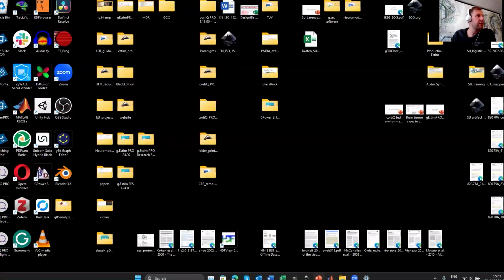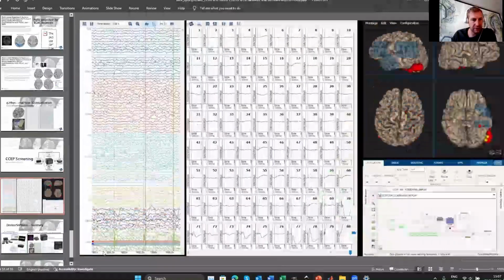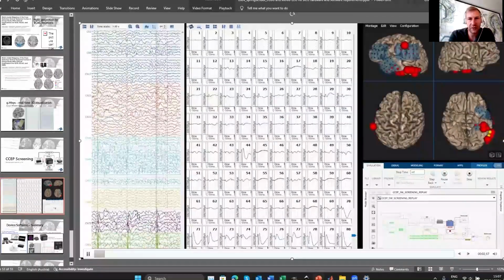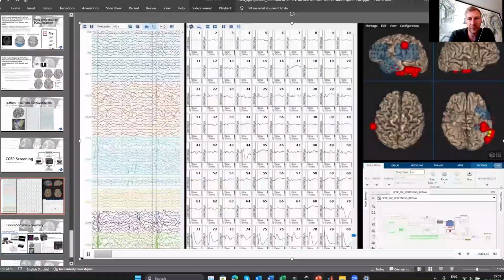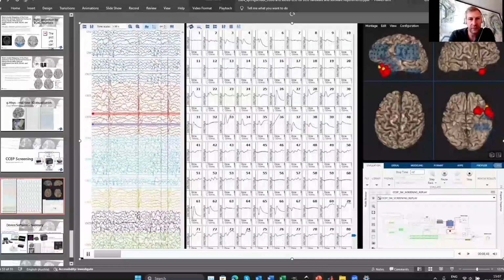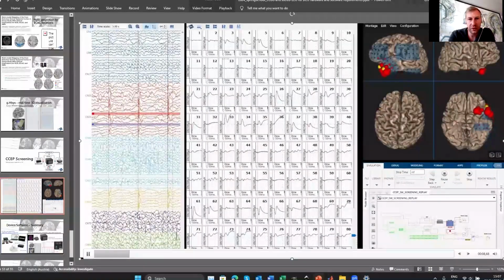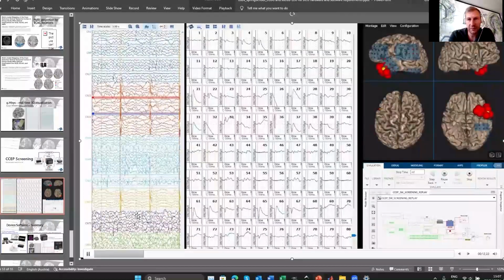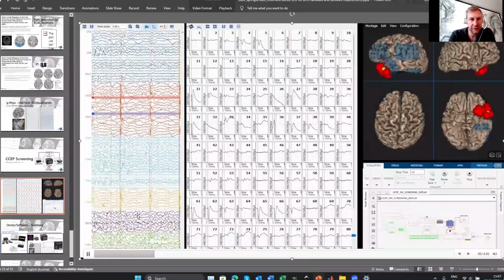Sorry, now my presentation just stopped. We can also show that here, basically, to stimulate and record in real time at the electrodes that we want.